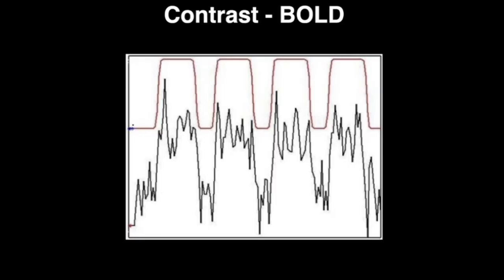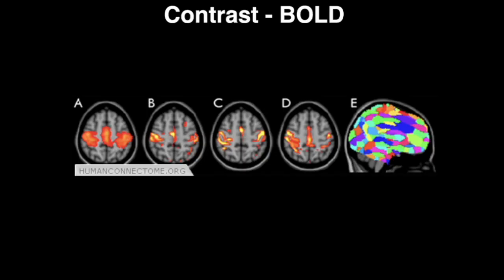When you're doing the task, you have more blood flow, more oxygenation, but you have an oversupply, so you have less deoxyhemoglobin, less dephasing, more signal. And this is at the basis of these statistical maps that we compute for our work, where we try to figure out what parts of the brain are active, connected, etc. Okay.